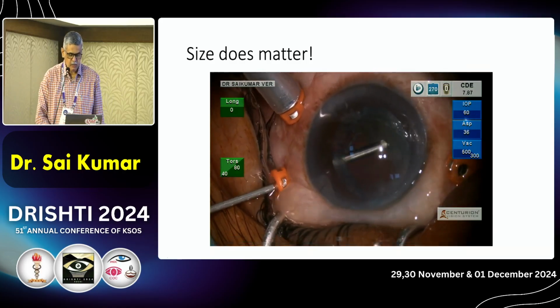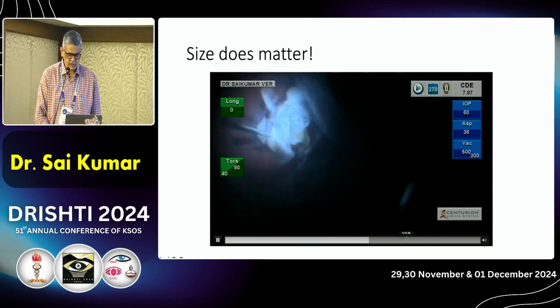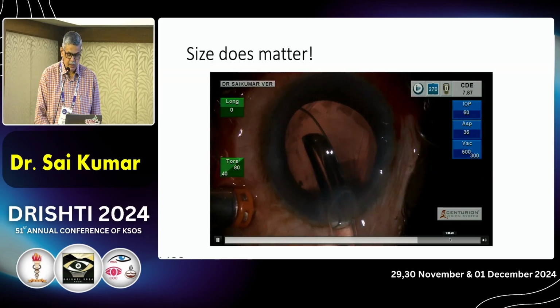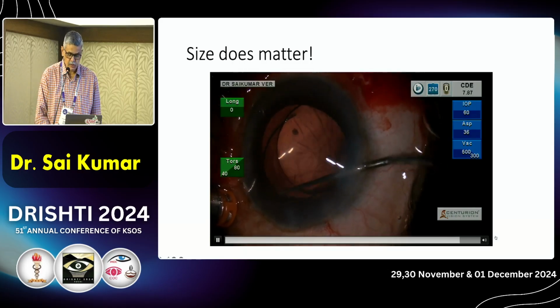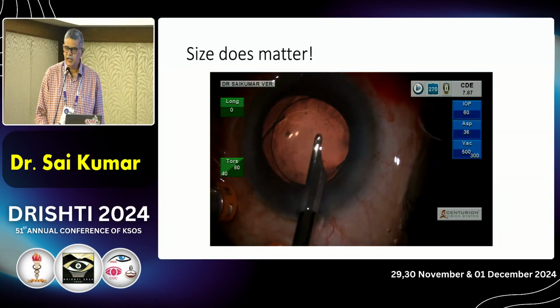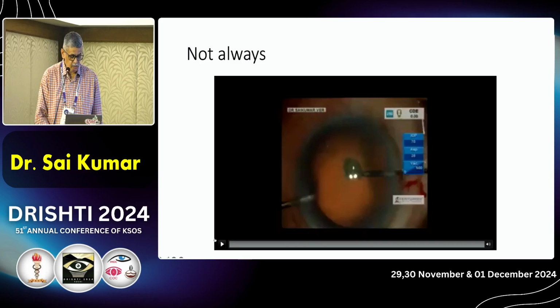Here I have my VR colleague who comes in and takes out all the pieces. Triamcinolone, PVD, all that is happening, and then in goes the 3-piece lens, with the optic captured. This patient actually does very well, and I have sutured the main wound as well.